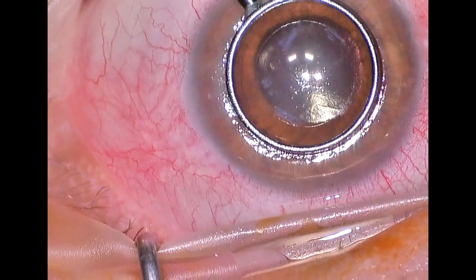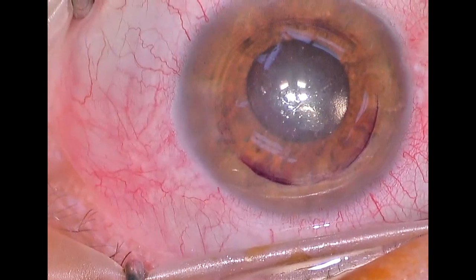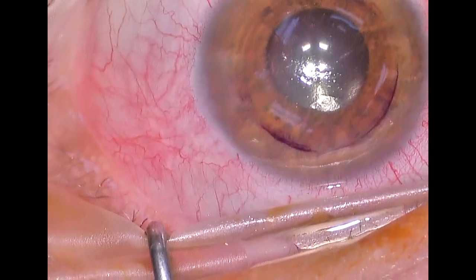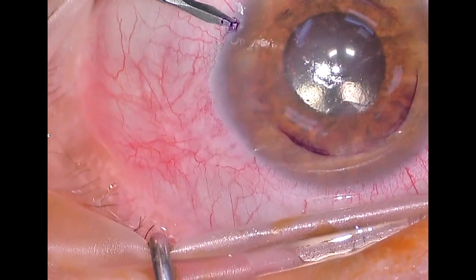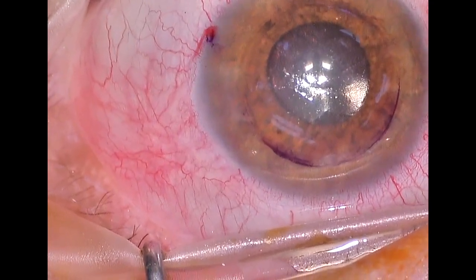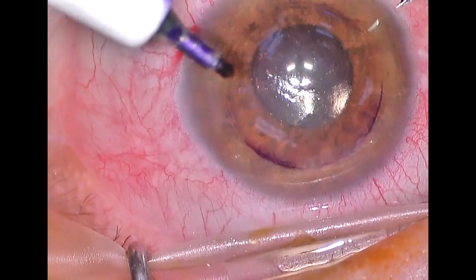The innermost layer of the cornea has a layer of cells that function to keep the cornea thin and keep it clear, and when those cells start to malfunction, they require a corneal transplant. We start by marking the cornea, the central eight millimeters, and then we make our side port incisions.